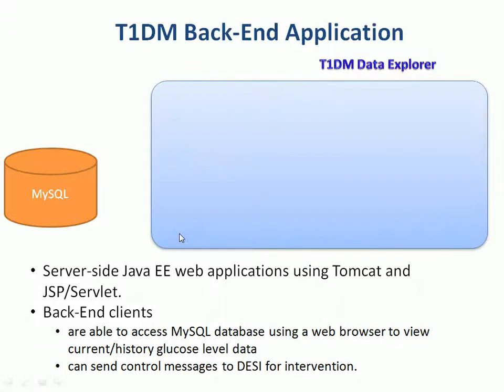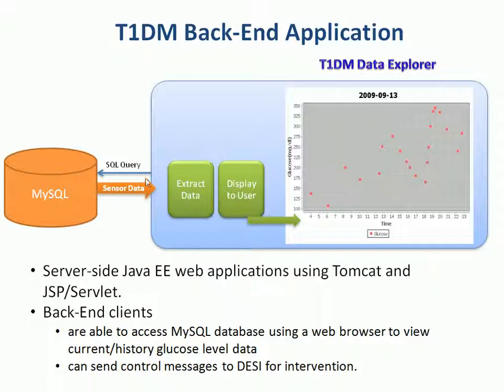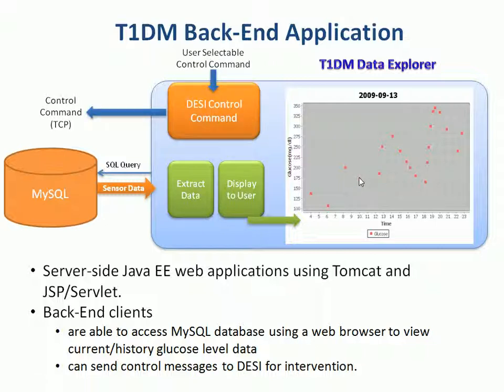And for the backend application, I use a server-side Java EE web application. So the doctor or physician can query the MySQL database using the web browser and display the data on the web, and also send a selectable control command to DESI. It will use Ajax to automatically update the data showing on the web page.